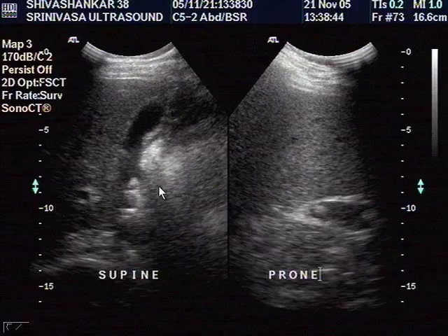When I did that, I expected to see one stone shifting, but actually I saw 1, 2, and maybe a third one as well, very faintly. So prone position can tell us a lot more information, especially in difficult cases.